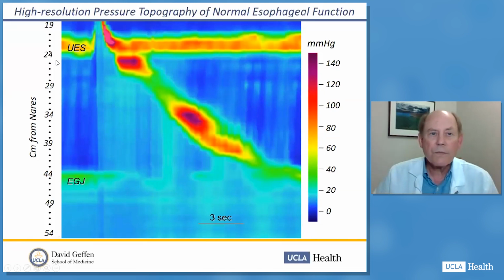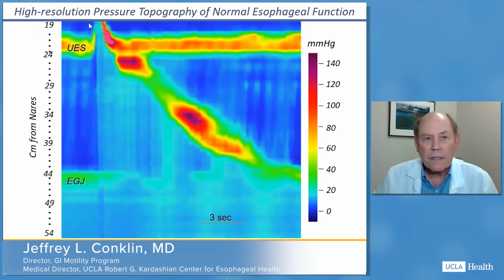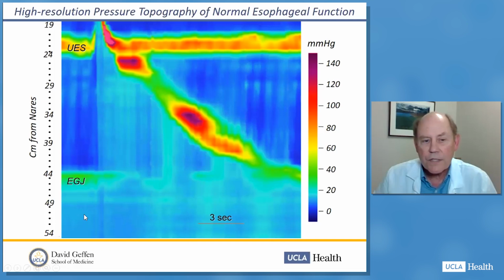Just a reminder, with high-resolution esophageal manometry, this band of color, color is pressure. Here's the relationship between color and pressure. This is distance from the nares, and this is time on this axis. This band of warmer color is the upper sphincter. Down here is the esophagogastric junction, and in this case, the lower esophageal sphincter.